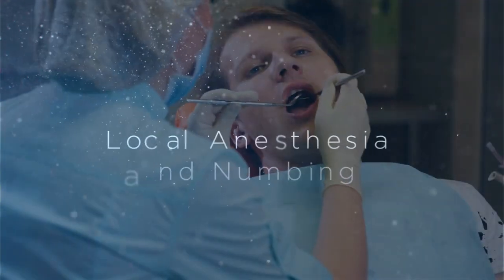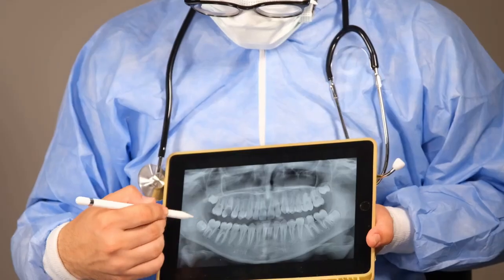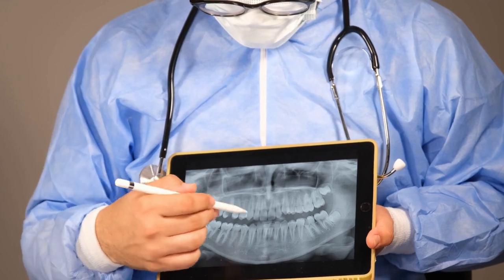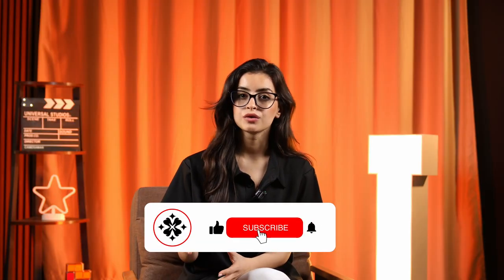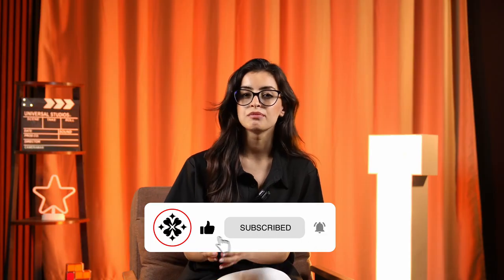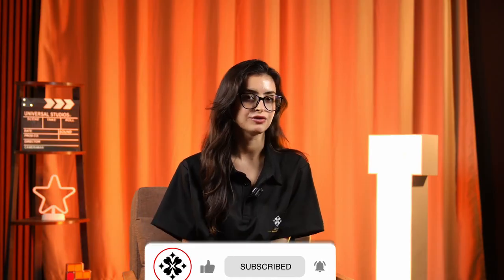Local anesthesia and numbing. Once you're ready for the surgery, your dentist will administer local anesthesia to numb the affected area. This ensures that you're completely comfortable during your procedure and won't feel any pain. While you may feel some pressure or vibration, you shouldn't experience any discomfort. The anesthesia will numb the tooth, gums, and the surrounding areas to make sure the procedure is pain-free.